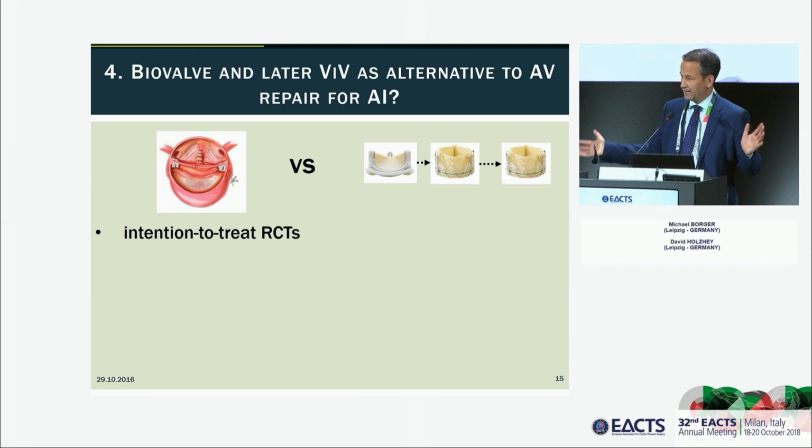27 or a 29 bioprosthetic. Again, I'm a big proponent of aortic valve repair surgery, and I do a lot of it, but this is not completely crazy thinking in these patients, because as we know, the valve-in-valve procedure is straightforward, it's quick, and it's got good results as long as the patient does not have a small aortic valve.